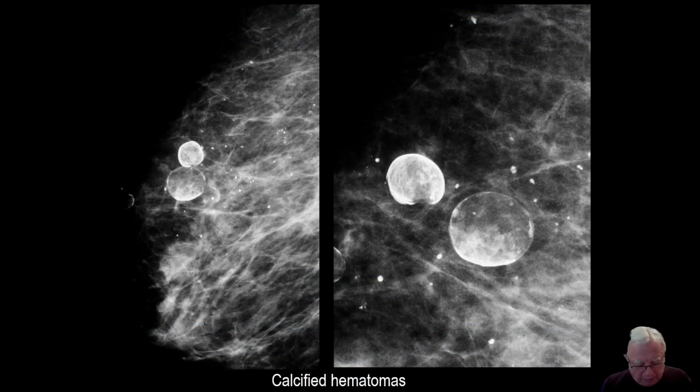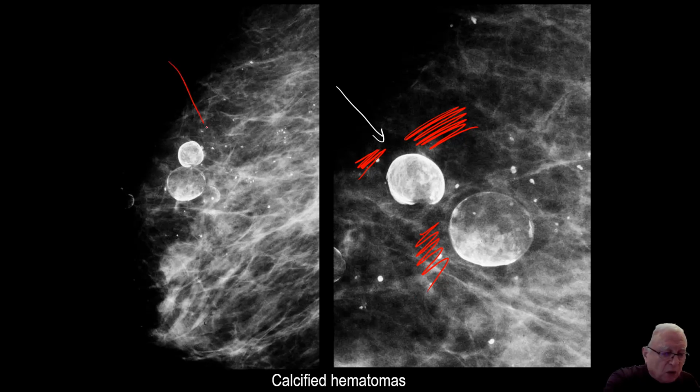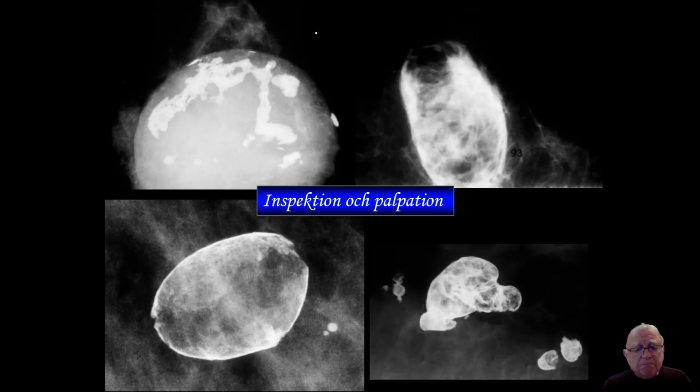Some examples. People are aging, and the old lady patient sitting in front of you has a little medal here, and it warns you, I'm taking blood thinning medicine. So a minor trauma immediately causes hematoma and larger hematoma. If you have this mammogram and you ask about trauma and the patient says, never in my life, never had one, don't ask it again. Because she indeed had the trauma, but she doesn't want to share the story with you.